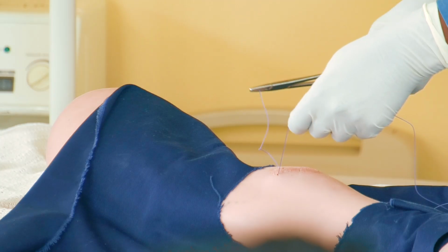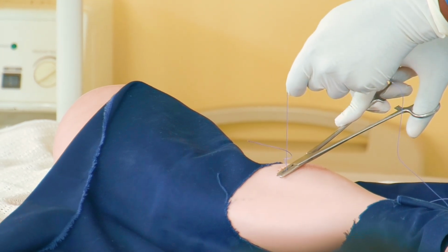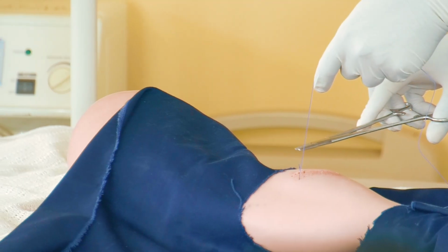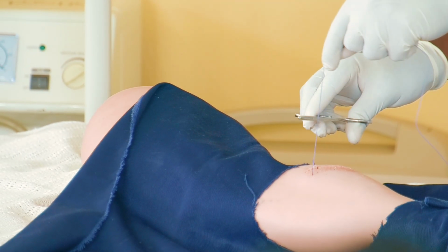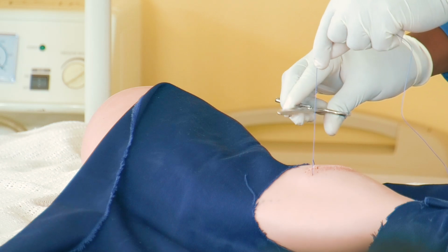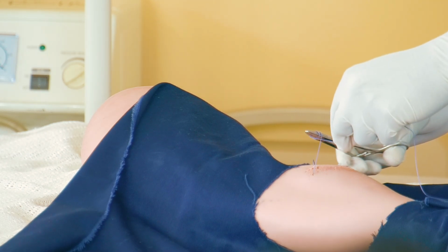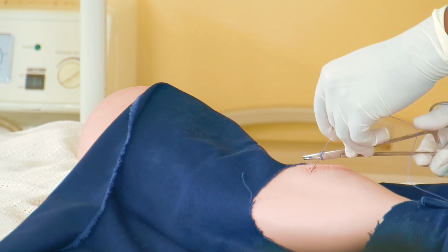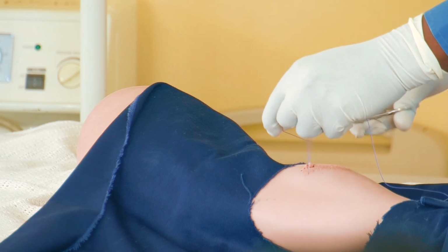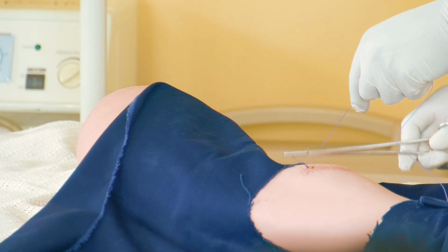Because one day you will suture someone, then later on they will come back that everything is open. So this one will point up like that. Right? Then if you want it to be stronger, go around twice, like 1, 2, right? Then I'll open, pick this other one here, right? The knot, for it to be stronger, the one that was this side will go, the other one will go the other way, the other one will come the other way.